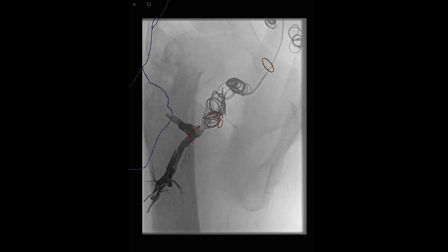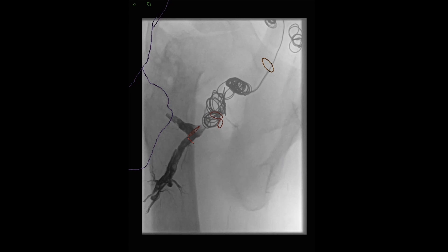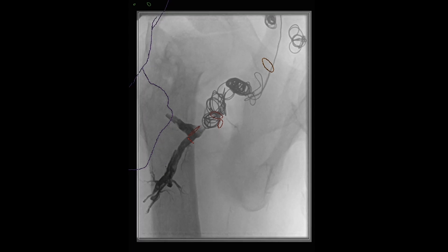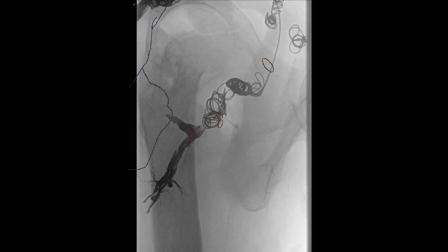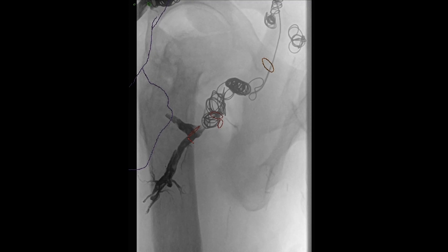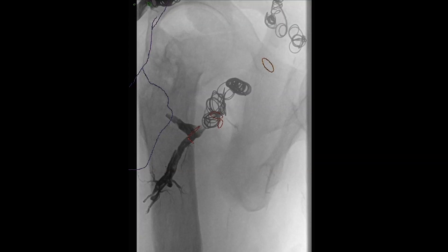An important point is ensuring adequate packing density. Start with bigger coils — probably 16s here — then work to smaller coils, filling the inside of the 16s with 8s and 10s. You can see we're in the process of the coil migrating, which is what you don't want. These are reconstrainable — as long as the coil hasn't been detached you can remove it, which is what we did in this case, and decided we were done.